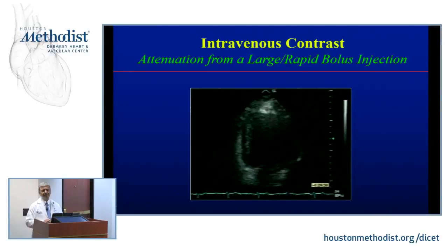Jorge Sharif, when he was with us, and now he's in Dallas, many, many years ago, I would say 25, almost 30 years ago, we took some of these contrast agents. It was Albunex at the first time. You put it in a little beaker, and you put an ultrasound on this. After a little bit, you start seeing the beaker itself, the first phase and the second phase. So, oh, that's interesting. Why does this happen?